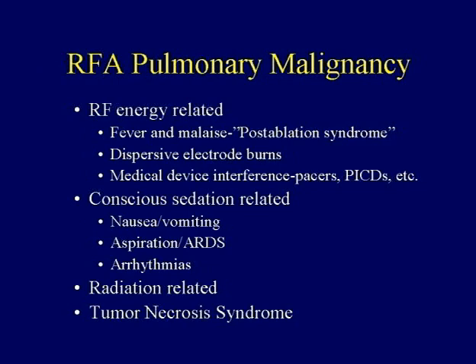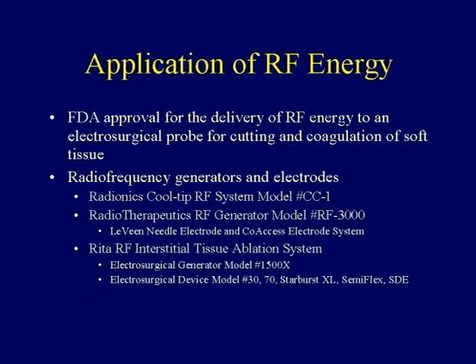Conscious sedation, we use a high dose of conscious sedation. We do not use full general anesthesia, but as a result, we are very conscious of the fact that the more drugs you give, the more likelihood you have of nausea and vomiting. Aspiration ARDS is obviously a concern, and so we try not to do these procedures on anybody who has eaten in the last 6 to 8 hours. Arrhythmias from drug interactions. There's, of course, potentially radiation related, although that's not been seen. And then there's the tumor necrosis syndrome, which is very similar, in fact, to the RF malaise fever type syndrome.